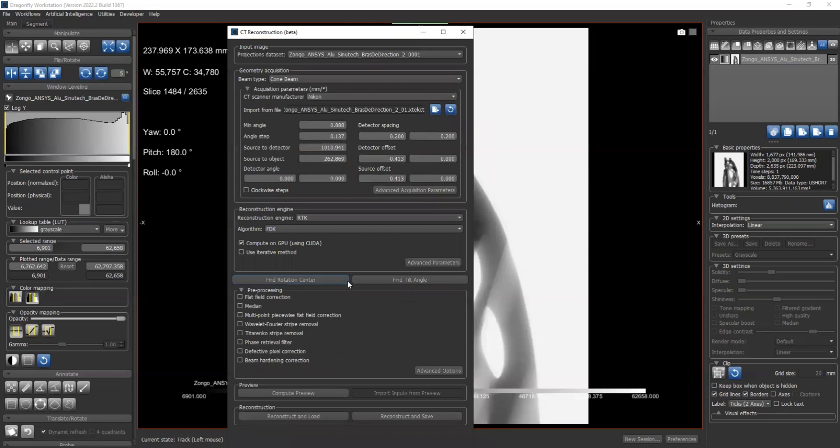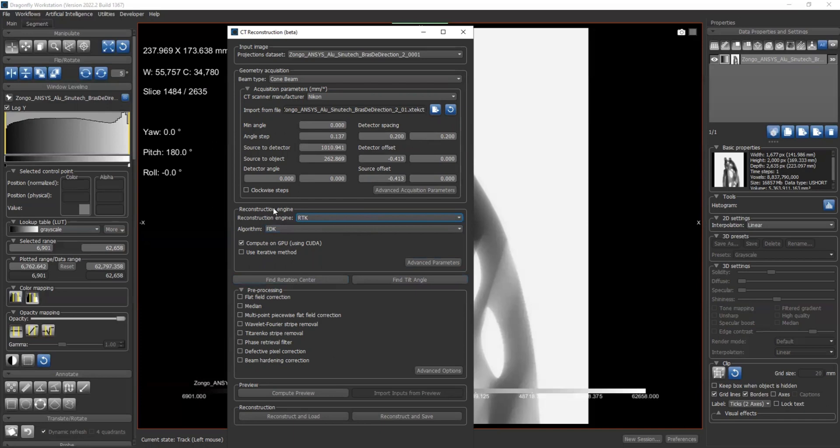So here we have two push buttons: find rotation center and find tilt angle. This is the geometry calibration part. I'm going to have another tutorial video to introduce more details about those two parts. But basically, they are used to find the detector angle and detector offset source of those parameters over here.